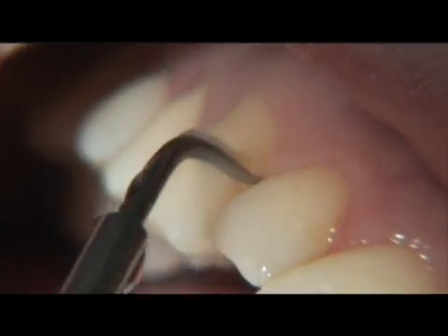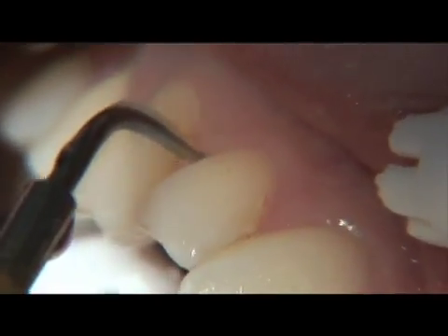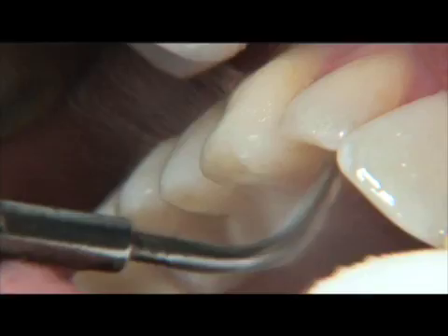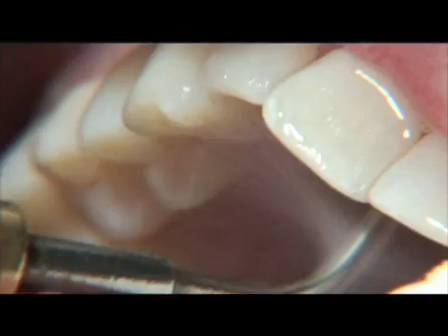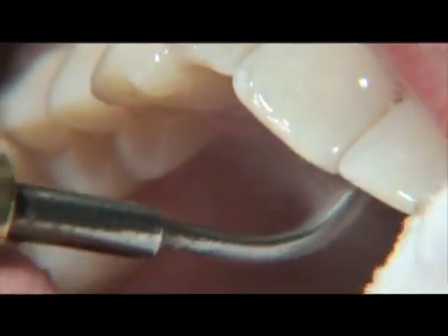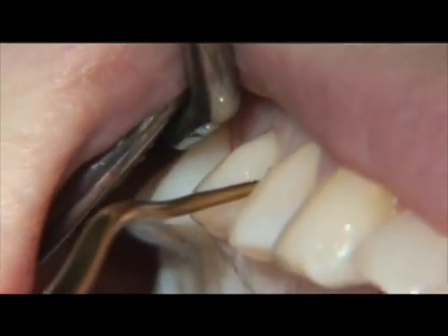This benefits the clinician and the patient by lowering sepsis levels in the aerosol given off by the spray of the ultrasonic instruments. This bactericidal effect helps reduce inflammation and supports healing within the periodontal pockets when used in combination with traditional periodontal therapy.